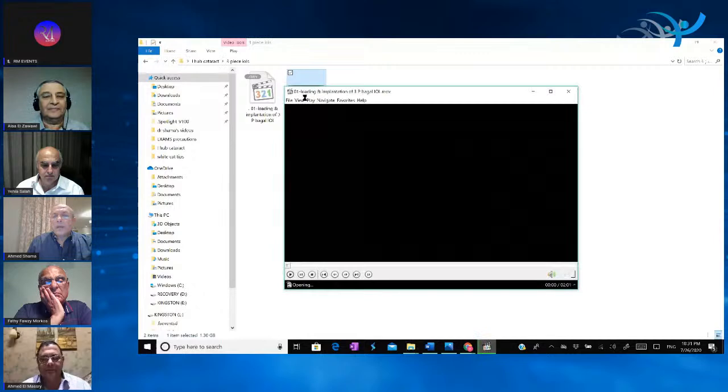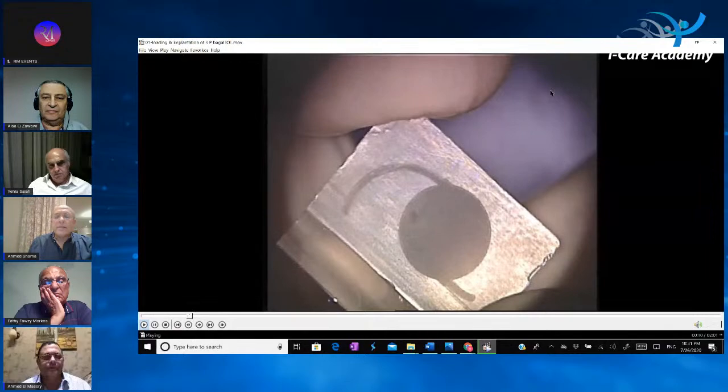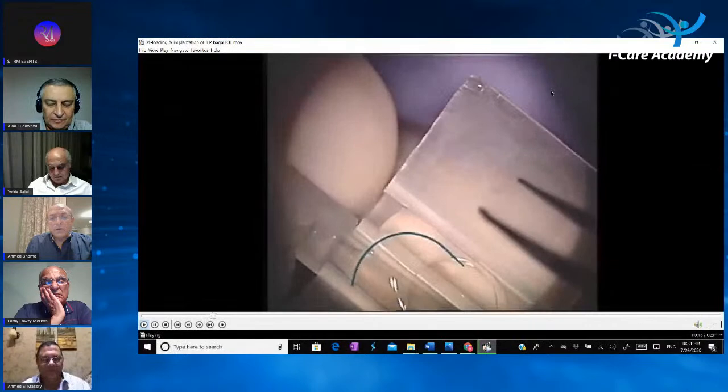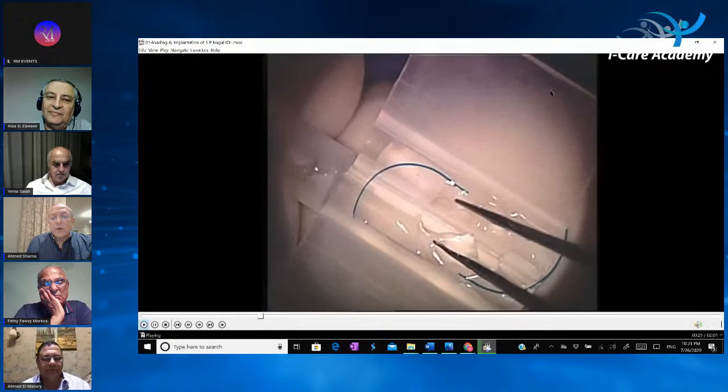I want to show you how I do the three-piece intraocular lens, because many of my colleagues are finding it difficult to do, and sometimes the haptics may be broken or bent. So I want to show you how I do it.